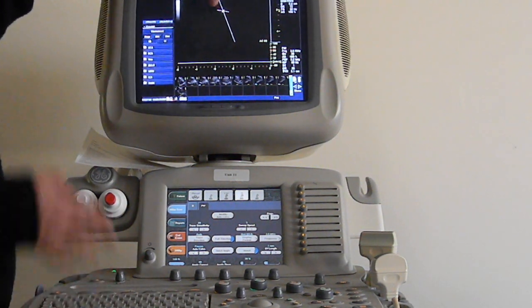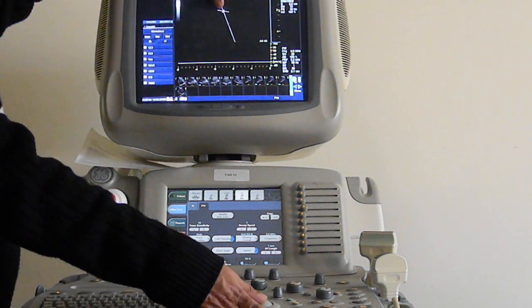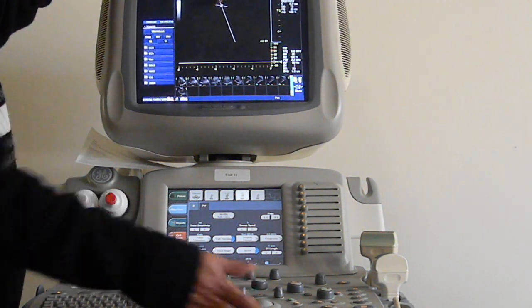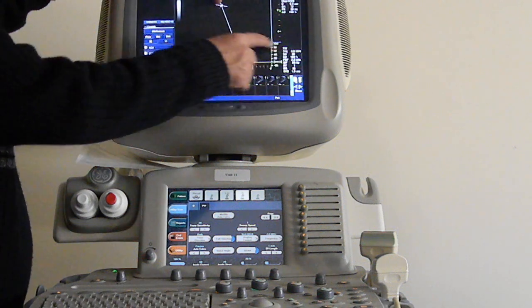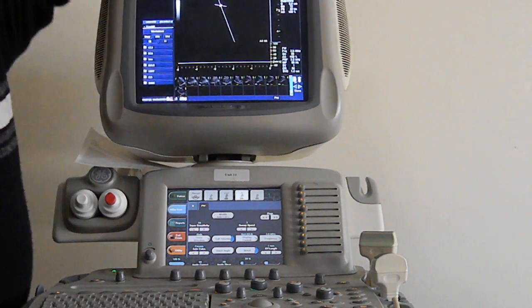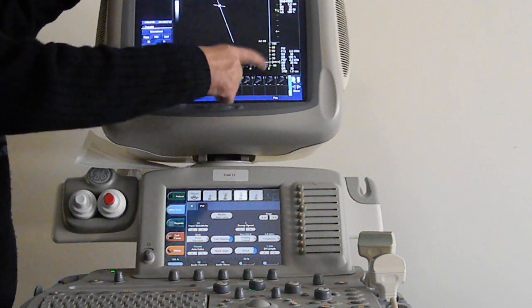So this always has to be inside the blood vessel for you to be able to get a Doppler reading. Right now we're scanning nothing, which means we don't have a blood vessel. But once you find one, place that in a blood vessel. What you will start seeing down here, because this here is your spectrum, is a graph.